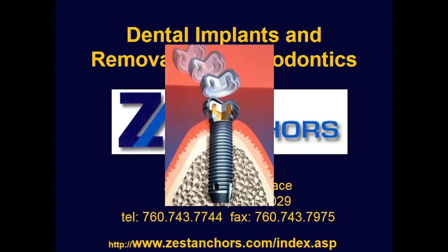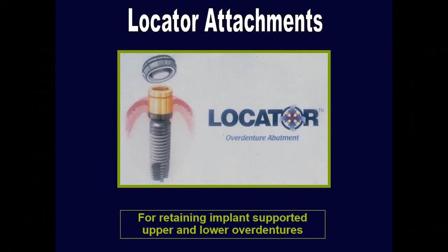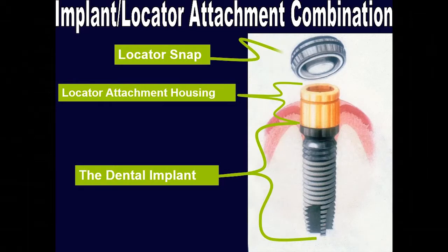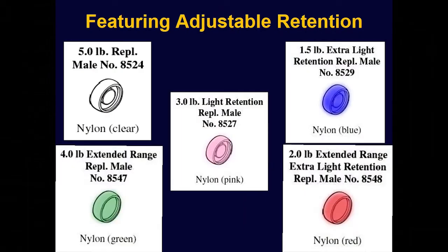The thing about the Zest is I think that it's probably the best attachment out there right now. It uses less vertical height than everything else that's available. The patient can throw the denture in and bite down and not destroy them. We don't recommend they do that, but they really do tend to hold up very well over time. And that's kind of our go-to until somebody else comes out with something better.